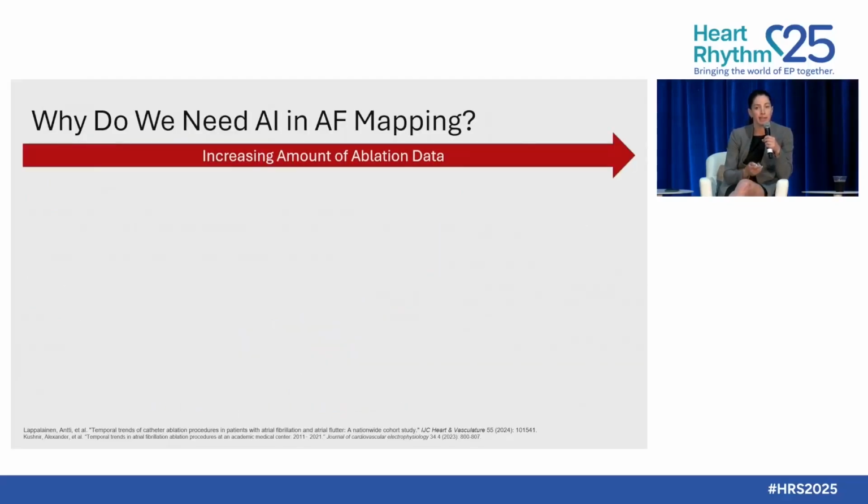And why do we need AI in AF mapping? One, there's an increasing amount of ablation data.